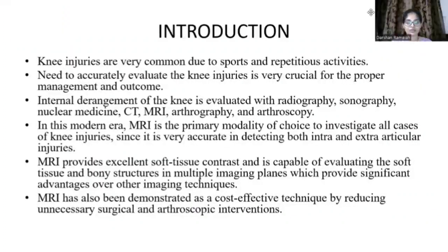Introduction: knee injuries are very common due to sports and repetitive activities. The need to accurately evaluate knee injuries is very crucial for proper management and outcome. The internal derangements of the knee are evaluated with radiography, sonography, nuclear medicine, CT, MRI, arthrography, and arthroscopy.